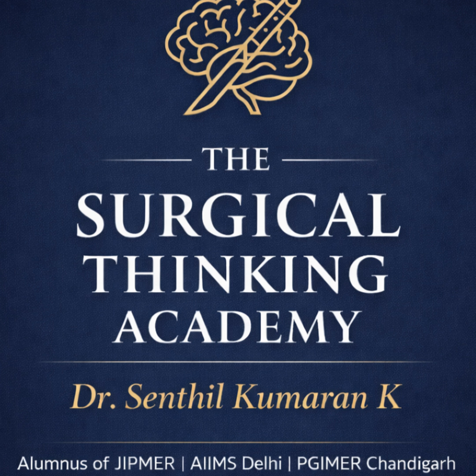And this leads to something that's almost unique in oncology. I mean, for almost every other cancer, breast, prostate, lung, the mantra is tissue is the issue. You have to biopsy it. Right. But here, we play by different rules. We do. If you have a lesion larger than 1 centimeter in a cirrhotic liver, and it shows that specific arterial enhancement and washout, you do not need a biopsy. The imaging is considered diagnostic.